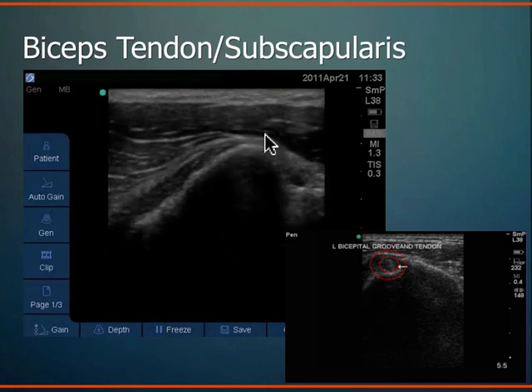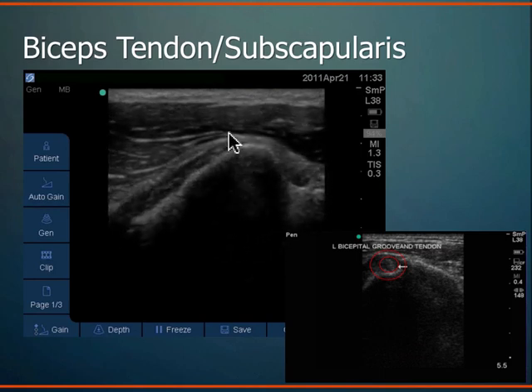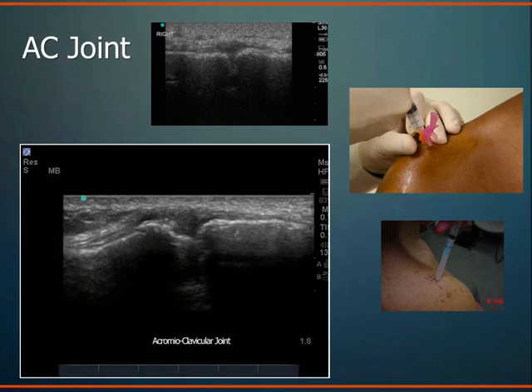And this is just the humeral head going into external and internal rotation. As it comes into external rotation, you can see the subscapularis coming across the top. So very easily imaged rotator cuff tendons on this modality, and you can see it quite well.